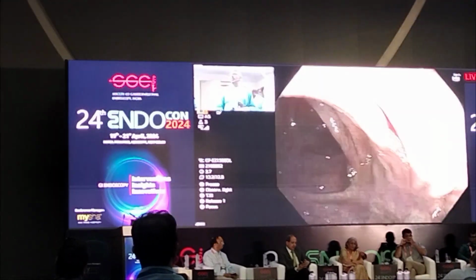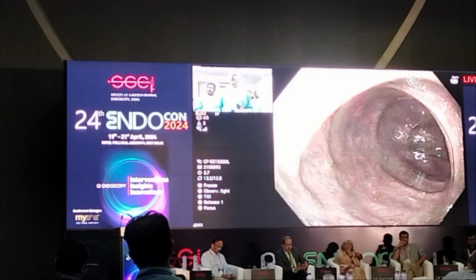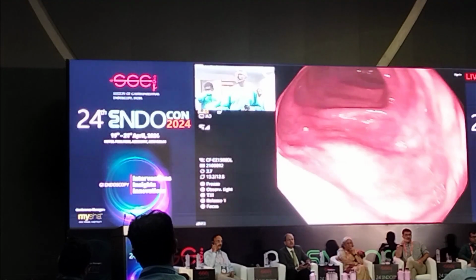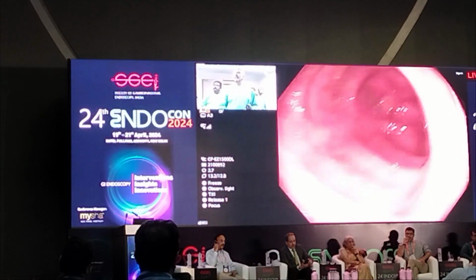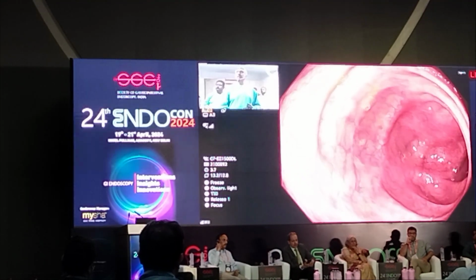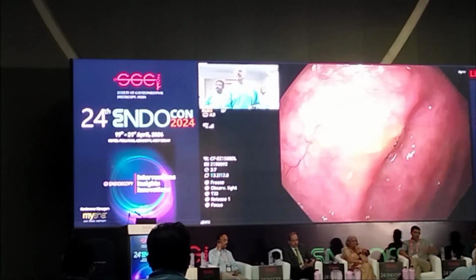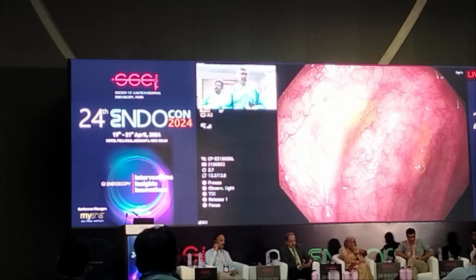And so we keep withdrawing. I'll change it back through to white light imaging again. So here we're back on the white light. And we continue to slowly withdraw. And obviously the key with any IBD, as with any colonoscopy, is examining the entire mucosa, or as much as we can see, because here you can see there's what we likely suspect is a sessile serrated adenoma.